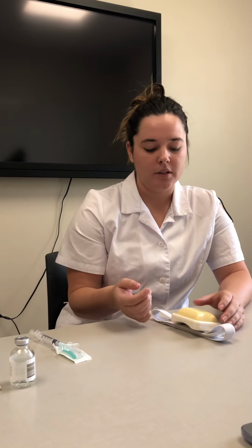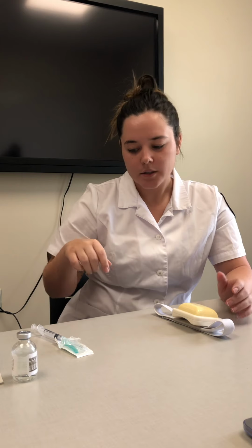So for an IM medication, you can give it in the deltoid, the ventrogluteal, or the vastus lateralis. It needs to be given at a 90-degree angle with the Z-track method. I'm going to be giving it in the deltoid using the Z-track method. So I get my alcohol prep and I find the area that I'm going to be using in the deltoid. I'm going to wipe it off, make sure to get it really clean, and work your way outwards. And I'm going to let that dry.